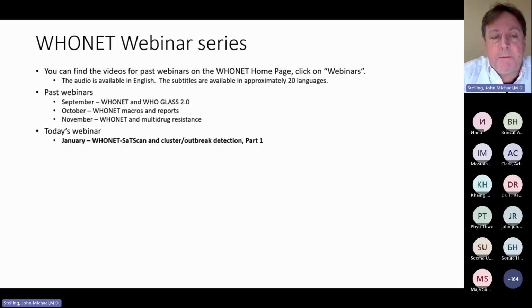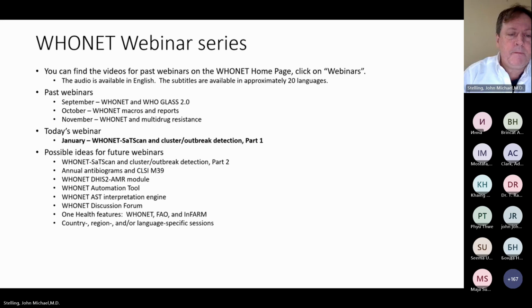The subject of today's webinar is WHONET-SaTScan and cluster or outbreak detection, part 1. It's an important large topic, so we may have 2 or 3 or more sessions about the WHONET-SaTScan features so that you have a good understanding.